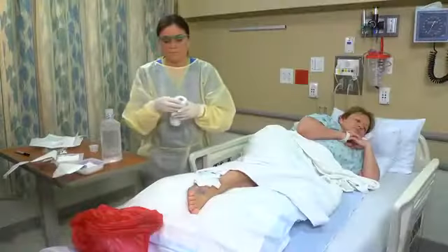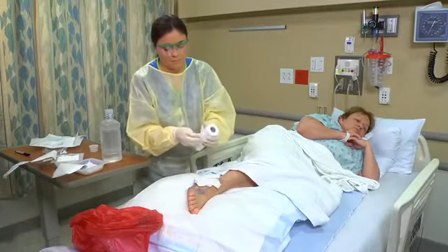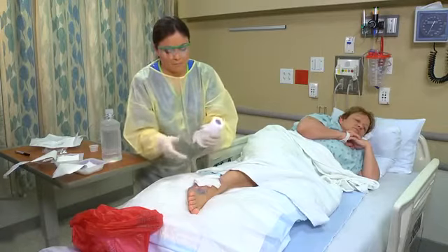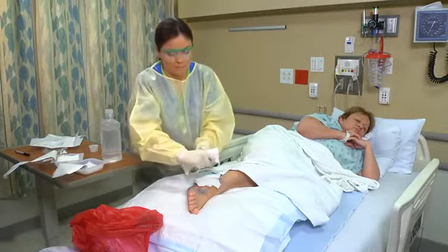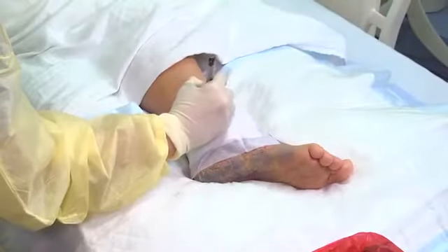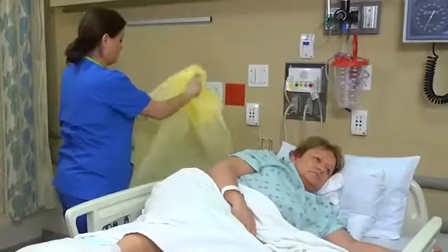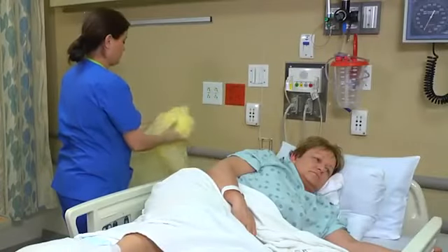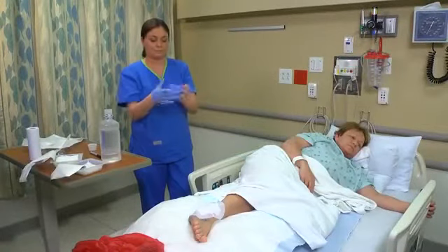Cover the wound with an abdominal pad, surgi pad, or gauze. Secure the dressing by taping one to two inches — that's two and a half to five centimeters — beyond the dressing, or by using Montgomery ties. Label the tape with your initials and the date and time. Remove any personal protective equipment used. Apply gloves and dispose of all used dressing supplies.